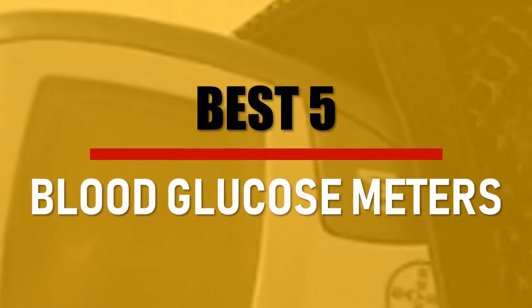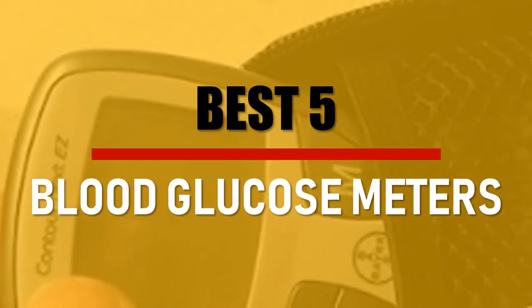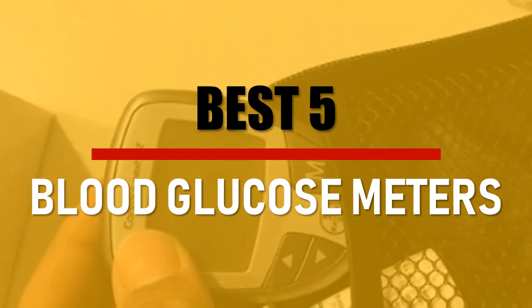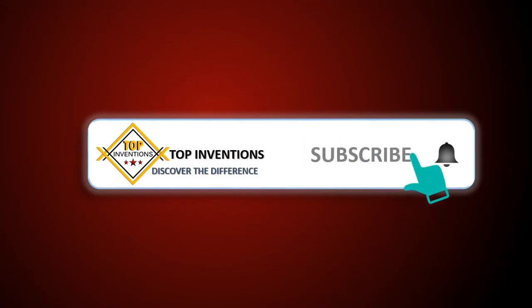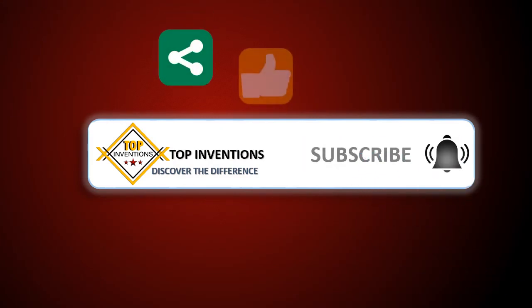In this video we are going to check out the best 5 blood glucose meters. Let's see the features to find the best ones. Best of 5.